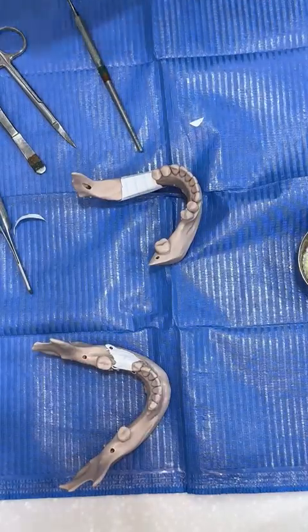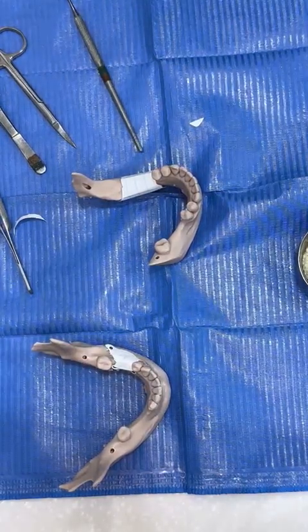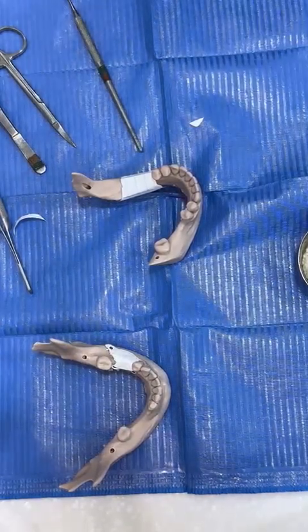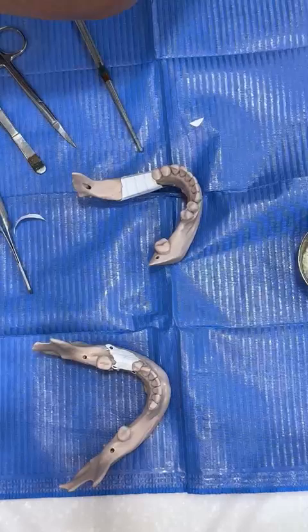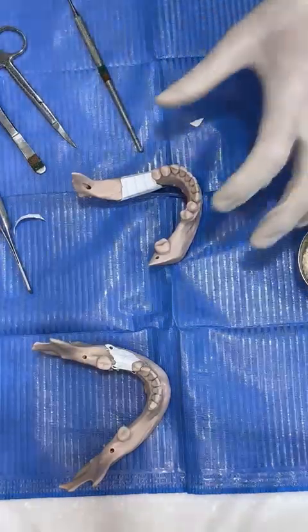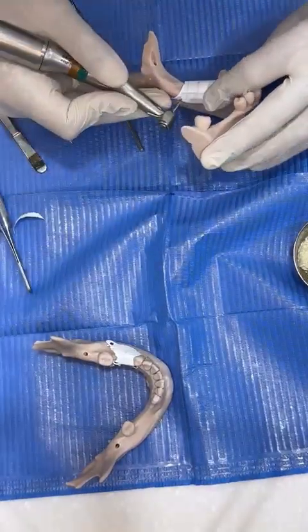Now I will put the first Profix. I will ask you to fix the membrane in place with the tweezer. Put gloves, please. Okay. Now I need the membrane to be in place.